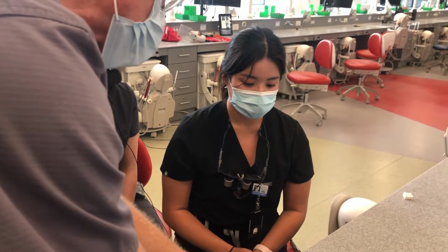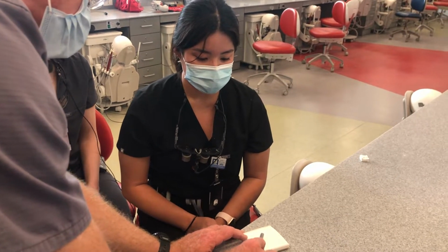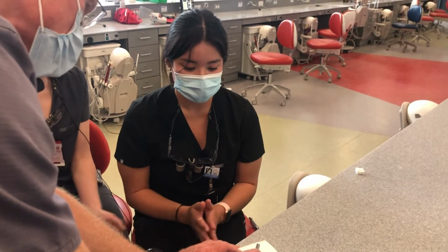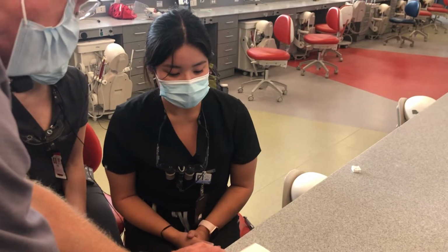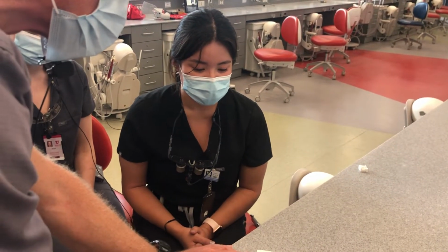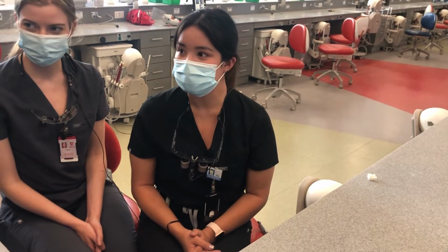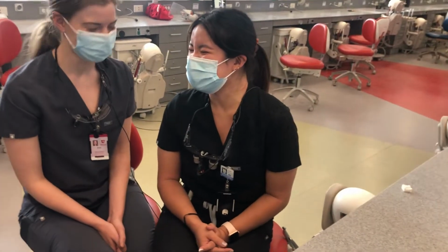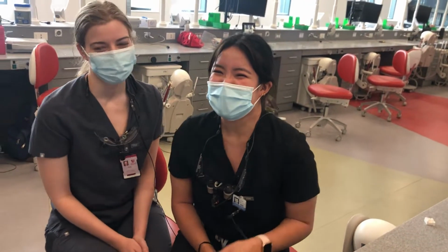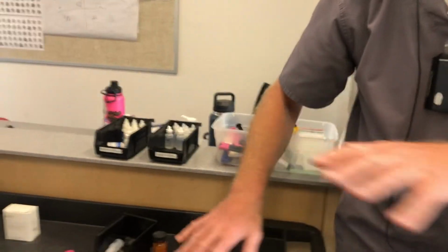And that isn't really a bad consistency for that stuff, it's just a little thick. It's about 1.5 inches. It'd be interesting to see if that sets. Let's see if that sets on us. Let's clean that up quickly. So, any questions with any of the kind of the permanent cements?